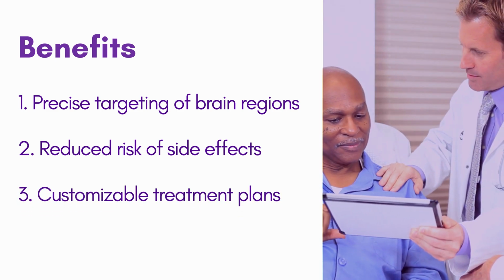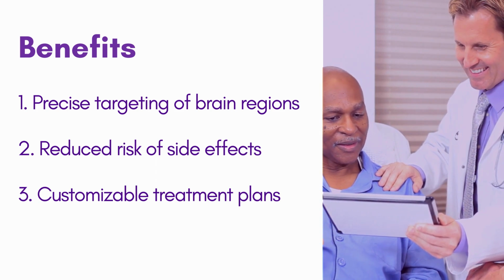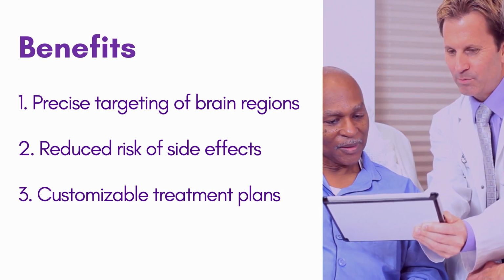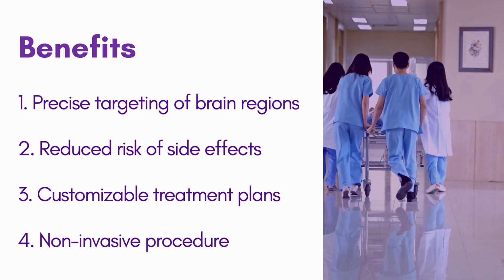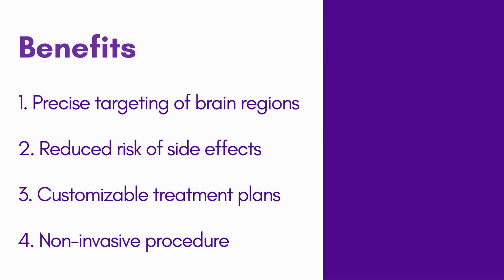Optimizing algorithms allow for the creation of customizable treatment plans based on the patient's diagnosis and symptoms. This means that the stimulation can be tailored to the specific needs of each patient. As was already said, TES is a non-invasive procedure that does not require surgery or anesthesia, making it generally safe and well-tolerated treatment option for patients. Now that we have a brief introduction, let's dive deeper into the terminology and related concepts.